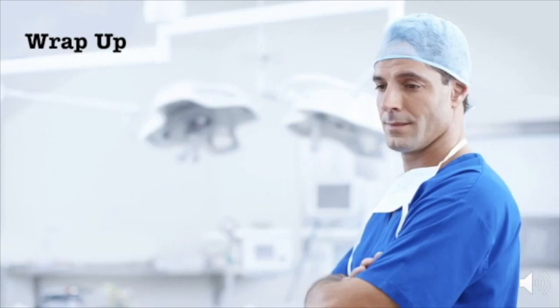Three, a stable arrhythmia. In this case, get to the nearest hospital for pharmacological stabilization. Four, unstable arrhythmia. It's okay to shock the patient. AP pad placement, disconnect the LVAD from the controller briefly while you do the shock. And finally, a coding patient. There is controversy about compressions, but it is okay to compress and shock. Make sure you place the pads in the AP position, unplug the LVAD from the controller as we spoke about with the unstable arrhythmias. That's it.